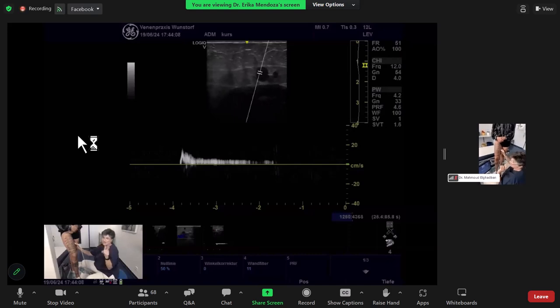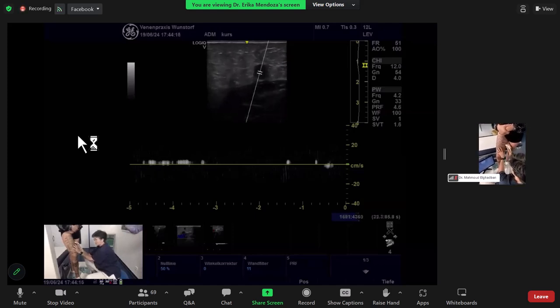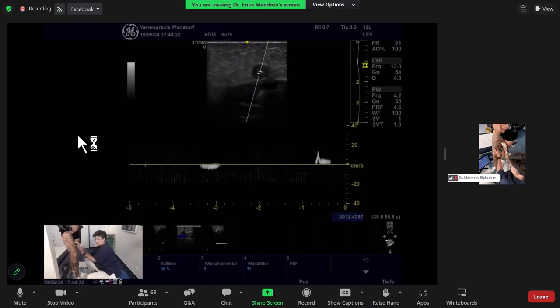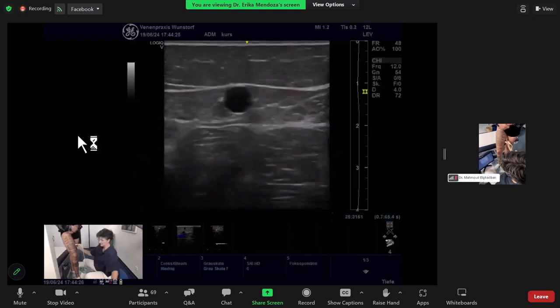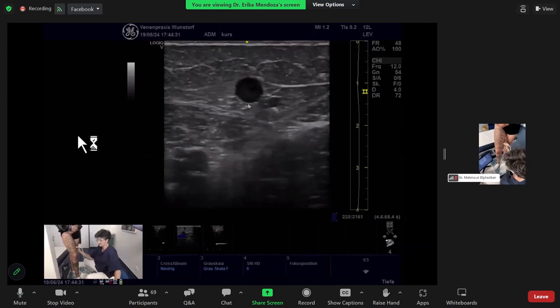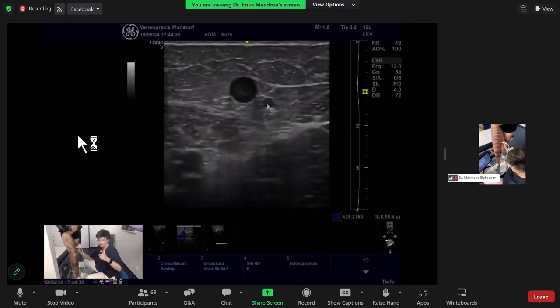And I saw the drainage pathway. So if I do CHIVA, I would just close the tributary and then get the great saphenous vein competent again. Attention, raise the toe, lower it. No reflux. I lower the finger, reflux. So if you close the vein exactly here, you get the great saphenous vein back from refluxing to anterograde flow.